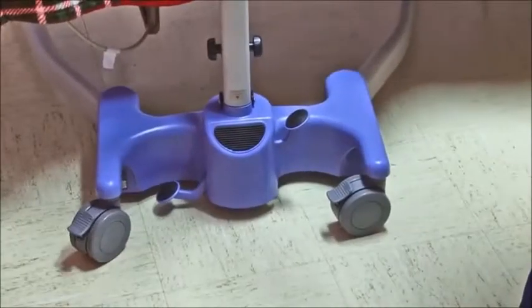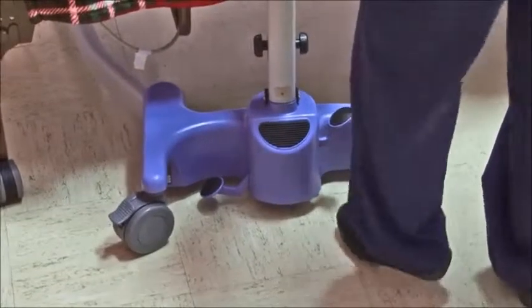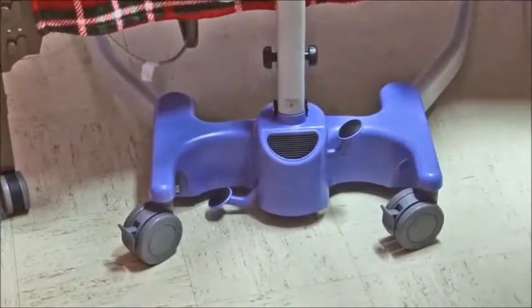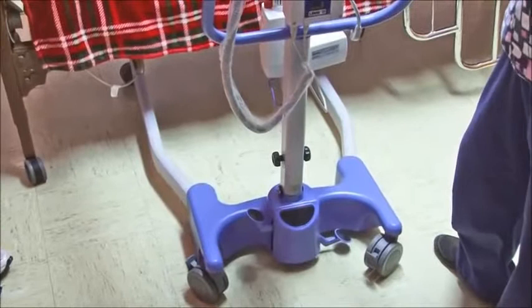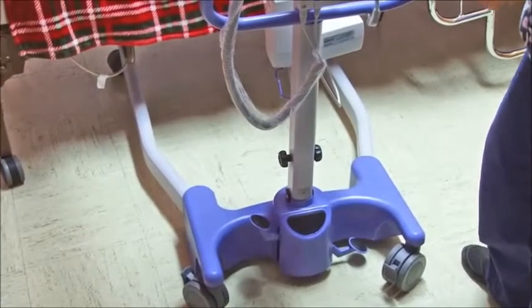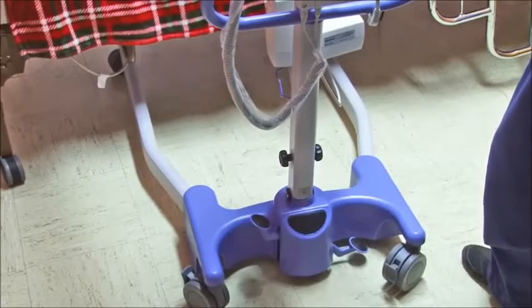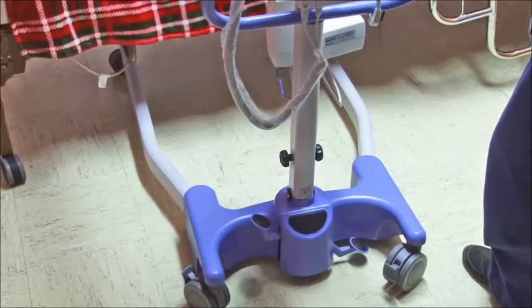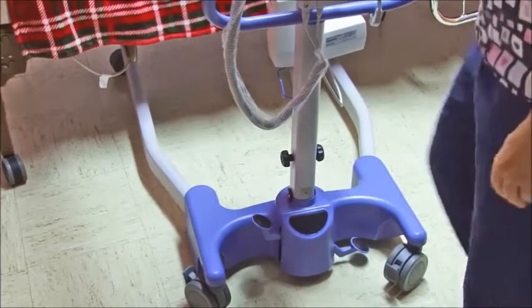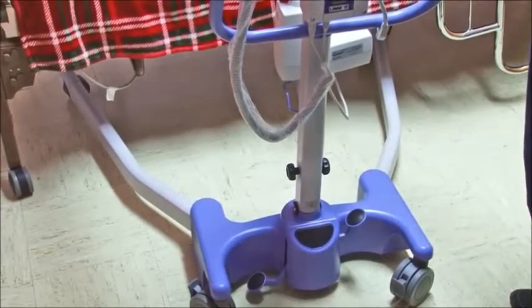Okay, we want to make sure that we stabilize the unit. You want to have everything locked down in position tightly, and then check it after you lock the wheels. Okay, that is locked. These are called the stabilizer bars. This is the narrow position that you can use for moving, getting around into a tight space, or fitting underneath something that's smaller. However, when we start moving the resident from the bed, we really want to make sure that we open this by stepping down and stabilizing, so that's very important.